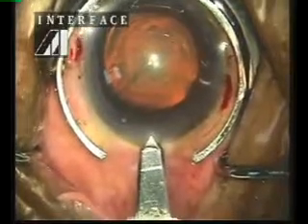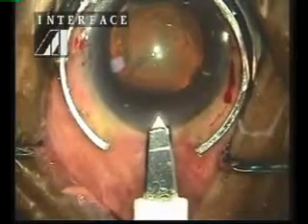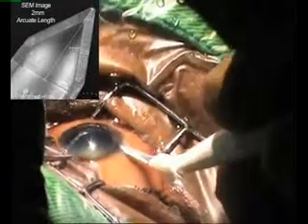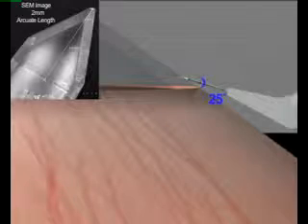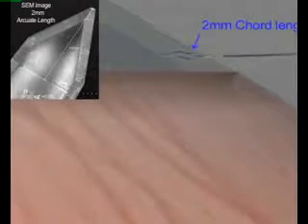The incision is created in trapezoidal fashion so that the internal lip is 1.8 mm, and the size of the external lip and the length of the corneal arcuate tunnel is decided by the surgeon as the blade is carefully advanced in a controlled manner. The incident angulation of the blade tip on the corneal tissue is recommended to be less than 25 degrees in order to create a longer stromal valve of at least 2 mm.